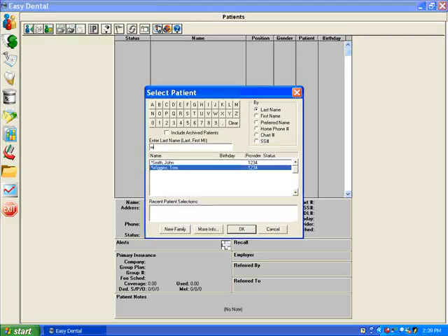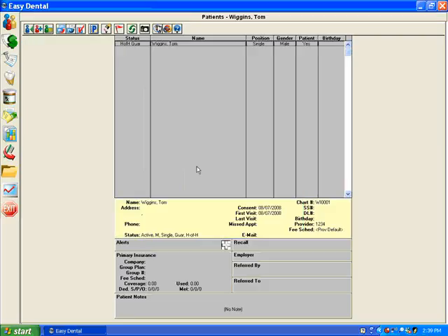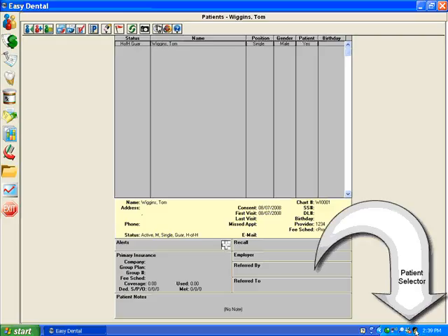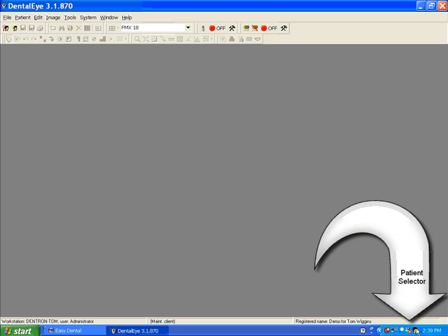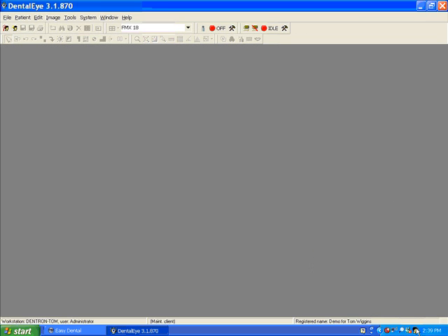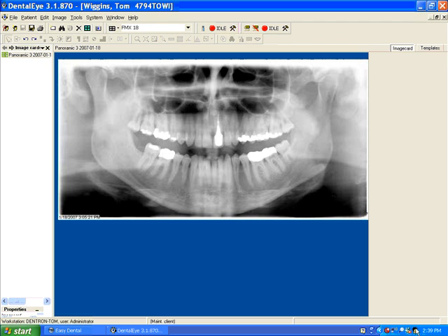Once the patient is selected, you simply click on the patient link icon in the lower right-hand section of the screen. Dental Eye will come up with that patient's images.